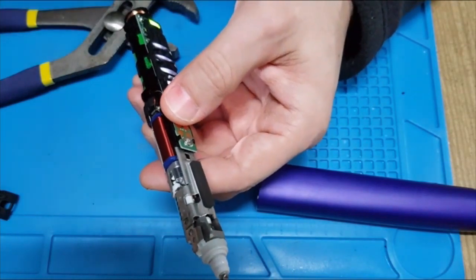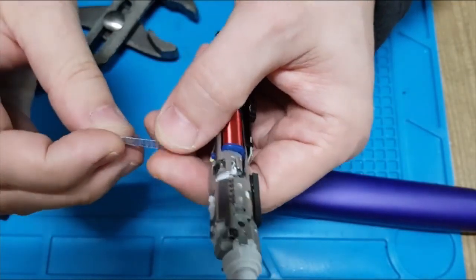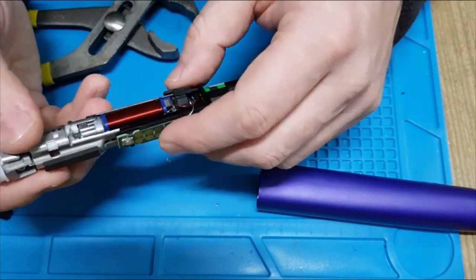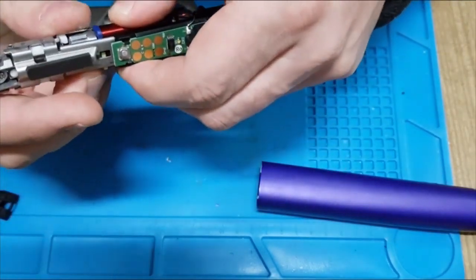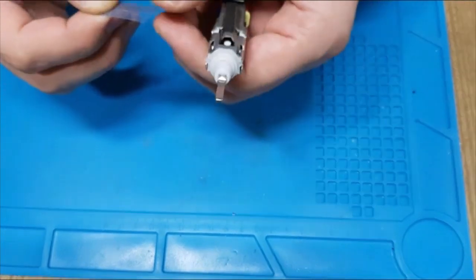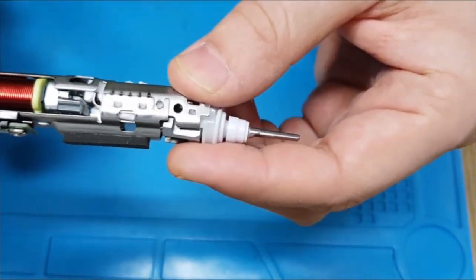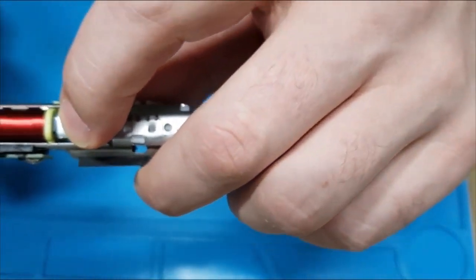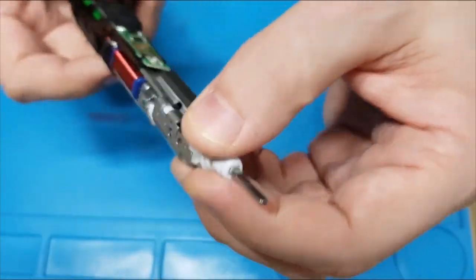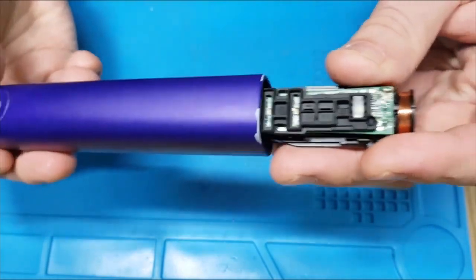So I'll just take two plastic pieces like this one, so it will be maybe 0.6, 0.7 millimeter of thickness. And the magnet will stay a little bit further away from the electromagnet, because now it still has some noise. And I've repeated the repair with two strips of these plastic pieces, and as you can see, now we have a good 1 millimeter gap between the magnet and the electromagnet, and so now we have a fully functional toothbrush. To assemble it, simply insert it back into its housing.